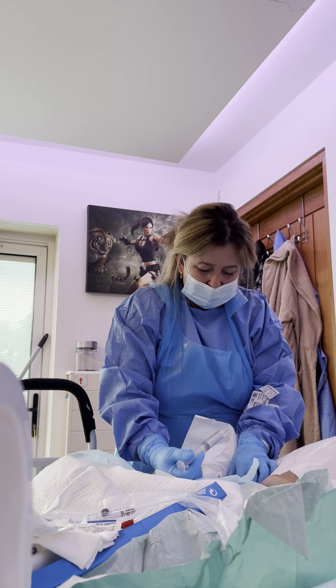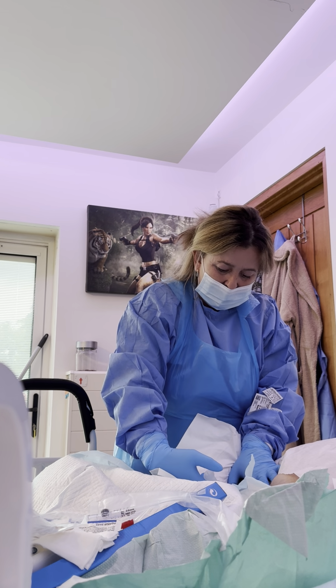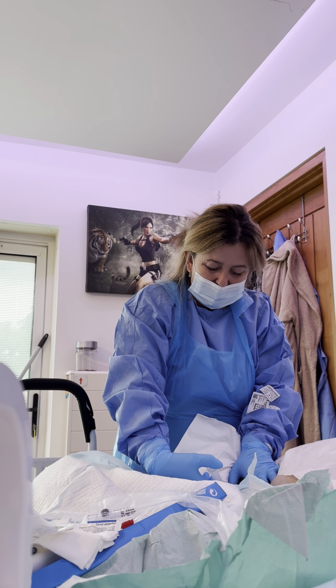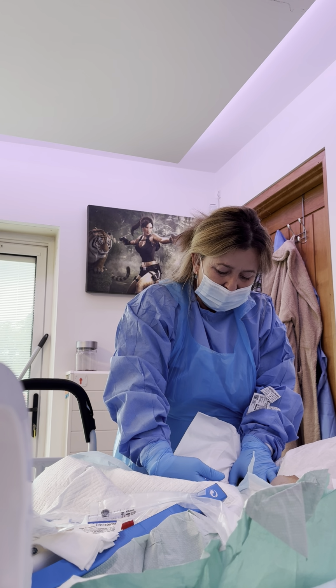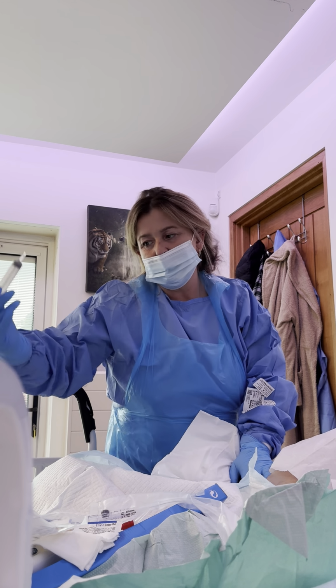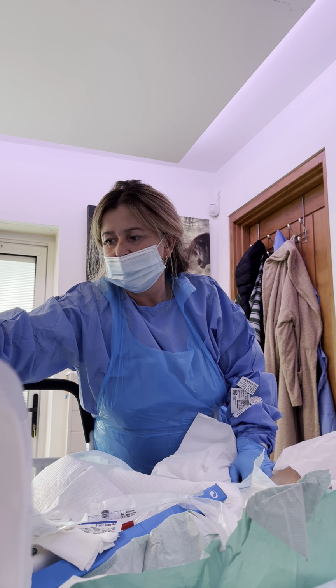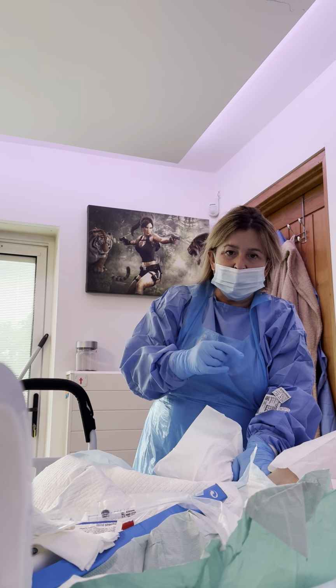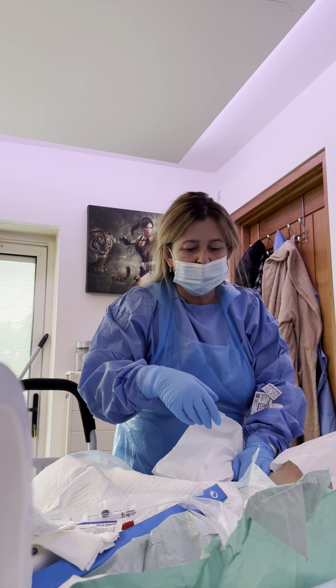Pinch and open. You won't be able to see it, unfortunately. And like I said, it would have been live, and somebody would have been with me to do this on camera and show you exactly, which would have been great. But you won't get to see that now for hopefully another 10 weeks. Okay? So that's in. That helped guide the catheter as well as give him a bit of relief inside.